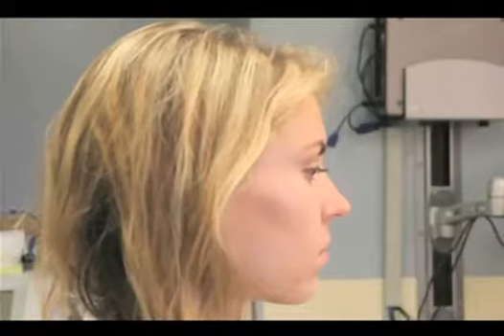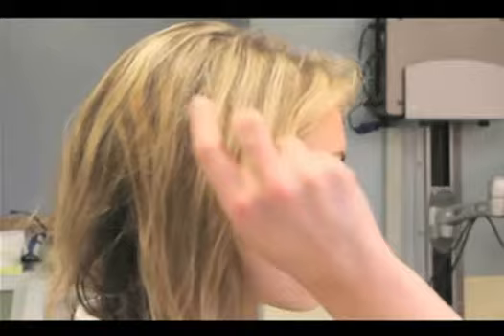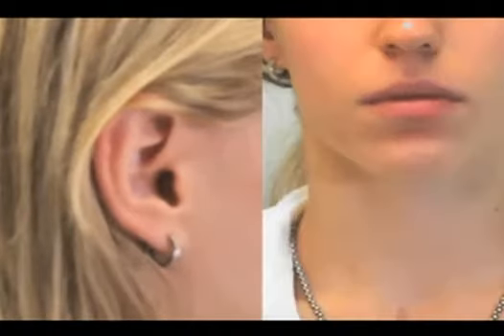Biopsies performed on the back can have poor aesthetic results because the scars may stretch. Avoid doing punch biopsies on the face whenever possible. If obtaining a specimen from the face is unavoidable, remember that scars behind the ears, under the jaw, and at the hairline are the least visible.